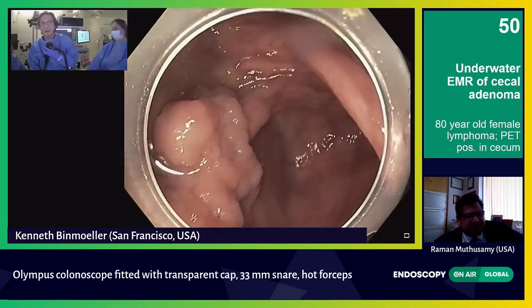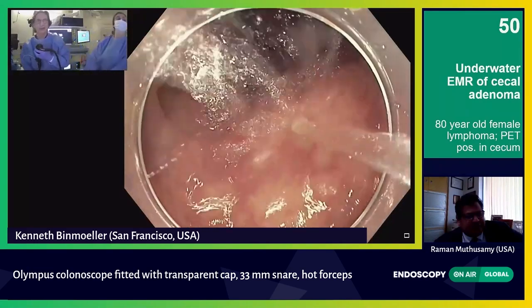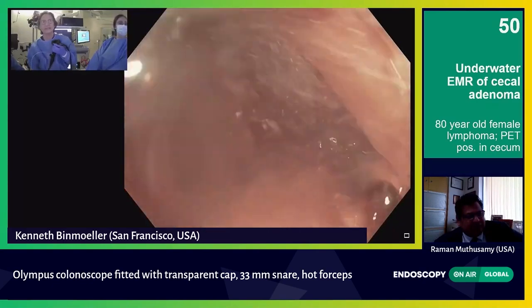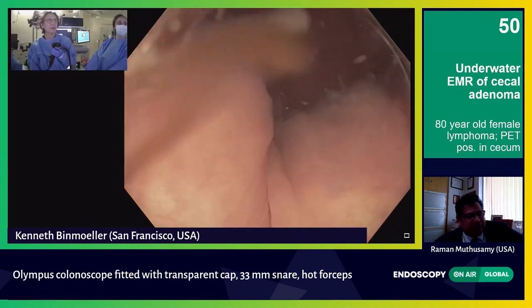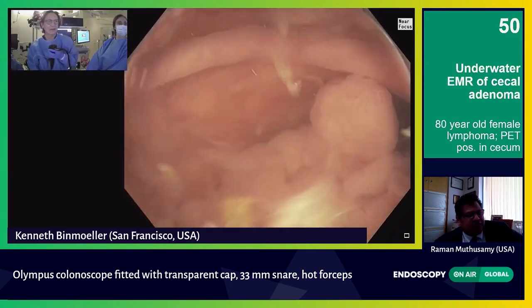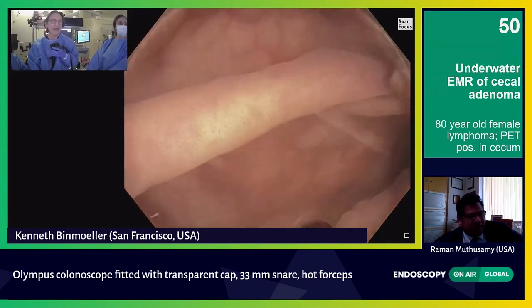Let's go underwater now and see what this looks like. I am aspirating out the gas. By the way, this is an adult colonoscope — it's the Q190 — so I have near focus, and I'm going to go on near focus now because that's going to allow me to really see this with better resolution. That's poor man's magnification.